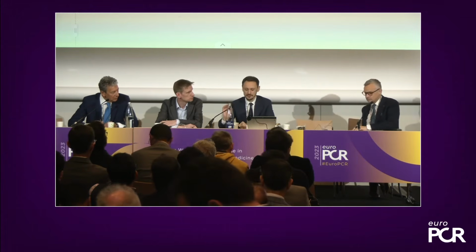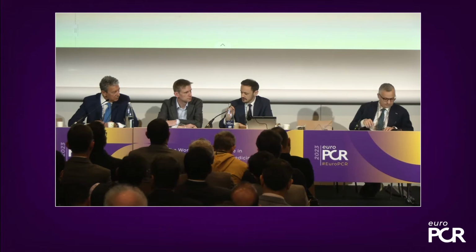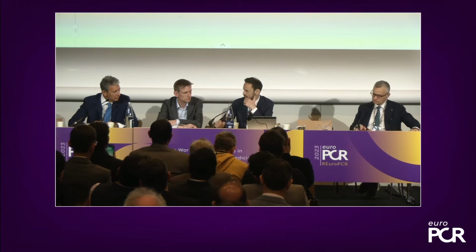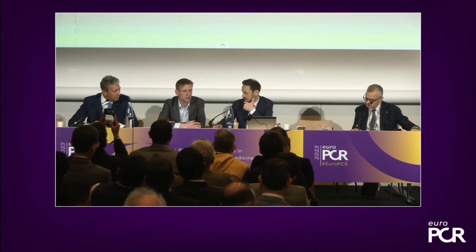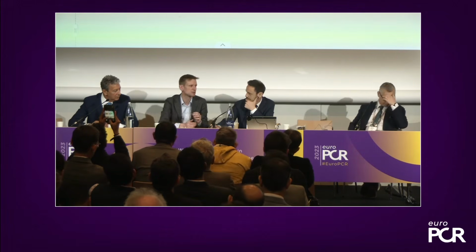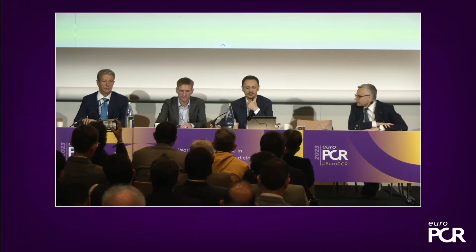Maurizio, we have a question from the chat, maybe for Ole. Is it needed to prepare the tunnel with a scalpel, or maybe to do some dissection of the tissue before deploying? I actually don't. No. Even if it's an obese patient with quite a lot of subcutis, I don't do it. No.